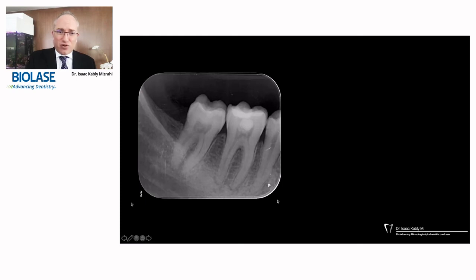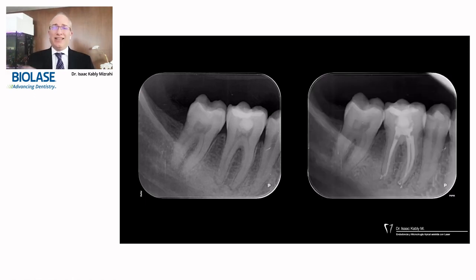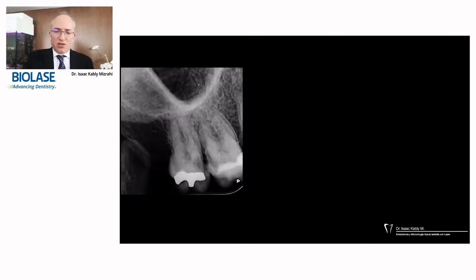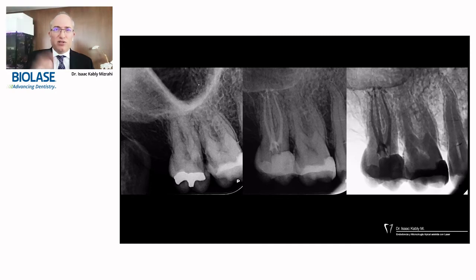Again, this necrotic tooth was finished in a single appointment. This patient was in a real amount of pain. We went to treat this molar with lasers inside the root canal, and we decompressed with lasers, and it drained, and then we could finish that drainage and stop that bleeding, and we obturated it in a single appointment, and the patient was really, really happy. Same example for a Christmas tree ending at a second upper molar.